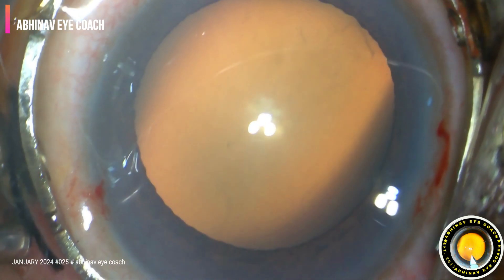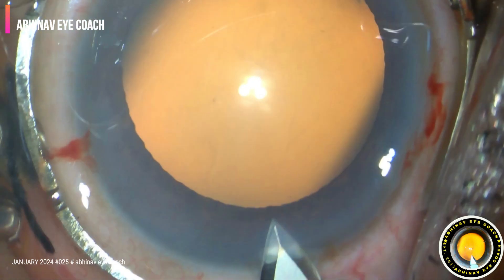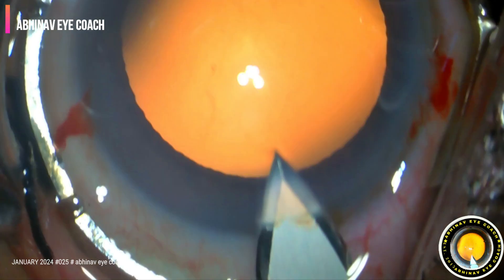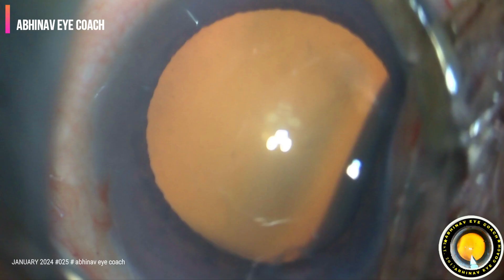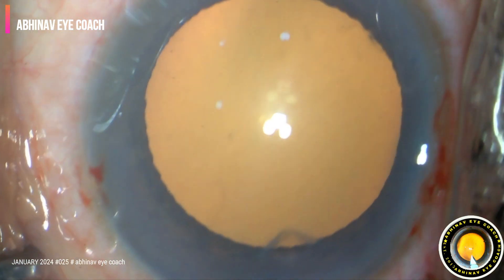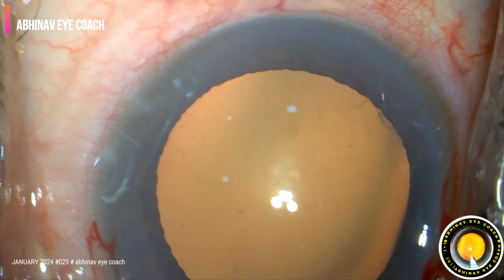Bright red reflex. Main port is made with the keratome square, nice incision. Good red reflex.